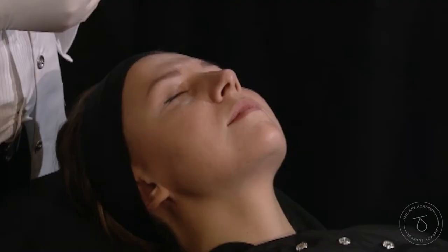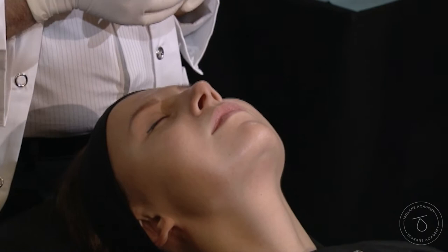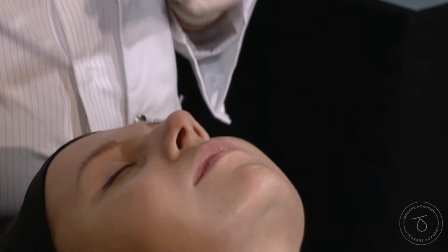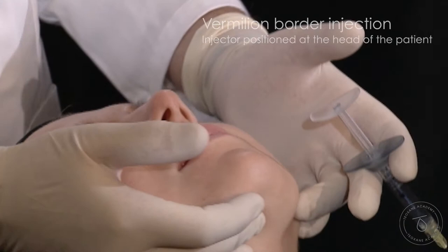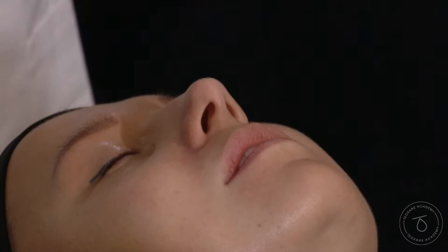So what's my technique? We said we have to improve the outline and the red part of the lips. I use a very simple technique — a very short needle, a 4mm 30-gauge needle, which allows you to control exactly what you're doing. Because with this length you can inject the outline. I work at the head of the patient, I pinch the lip, I see the outline. And usually, to be very precise, I mark with a pencil the way out of the filler.